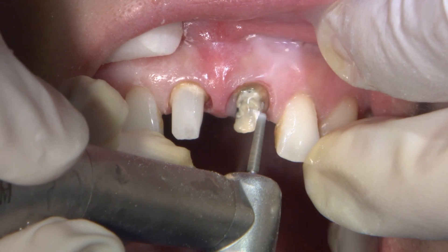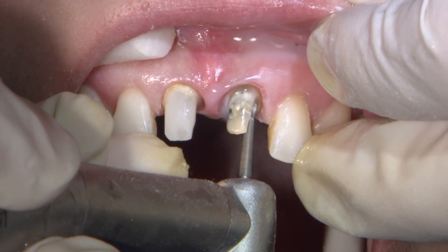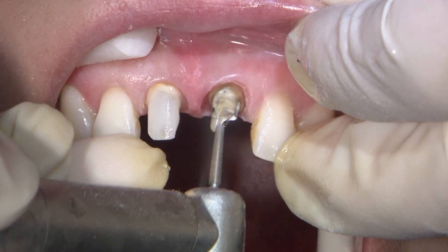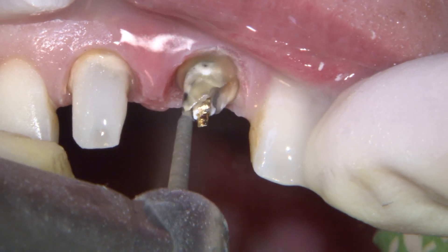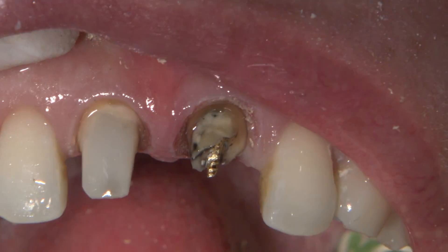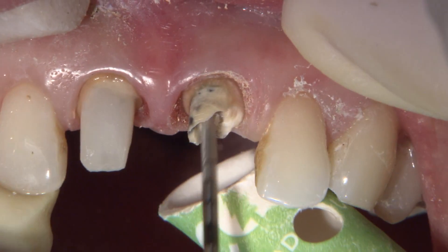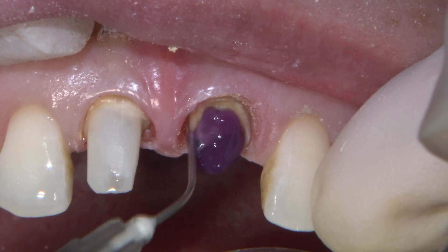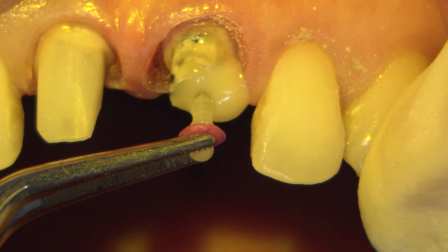I wasn't planning on redoing the buildup on number 9, but I noticed some voids during the prep refinement, so now I'm removing as much of the buildup without disturbing the post. I switched to a flame shaped diamond to carefully remove material between the post and tooth structure. As you'd expect, the post loses retention and is now removed. I'll repeat the same fiber post process as I did on number 8 — first establishing enough width and depth of at least about two-thirds down the osseous root length to accommodate the post — then etch, bond, and cement using Rely-X Ultimate once again.